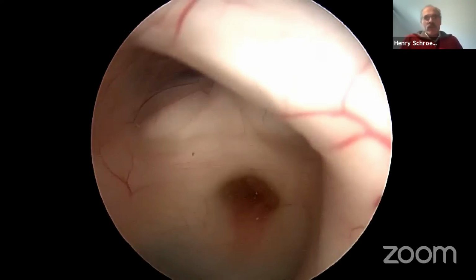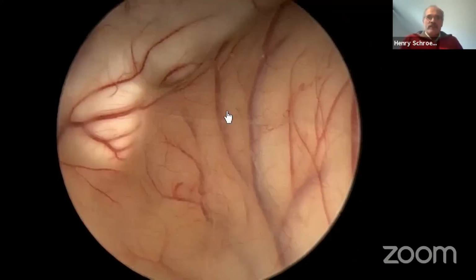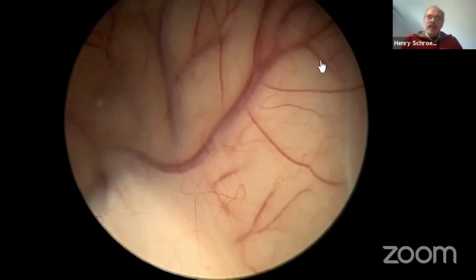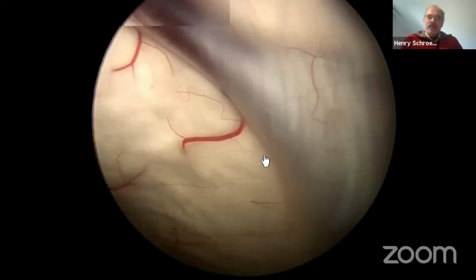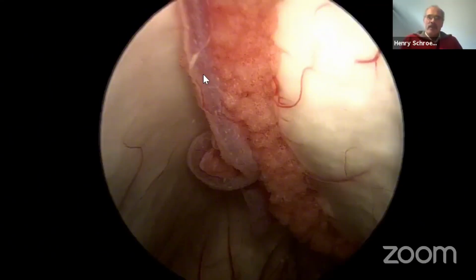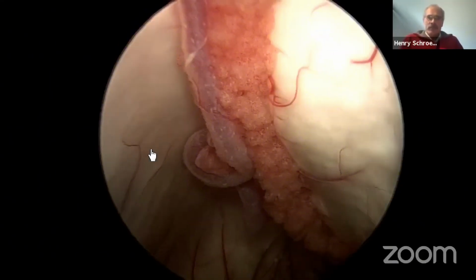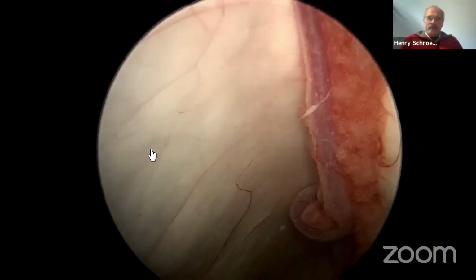And then we come back with a 45-degree endoscope. You see the head of the caudate nucleus. And with 45, really, you have a radar-like view. You see the caudate nucleus running here, thalamostriate vein, thalamus here, choroid plexus, choroidal vein, septum pellucidum, moving.